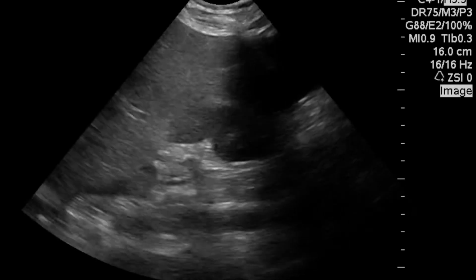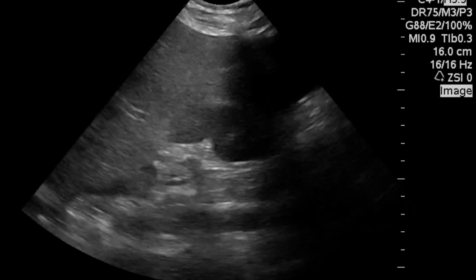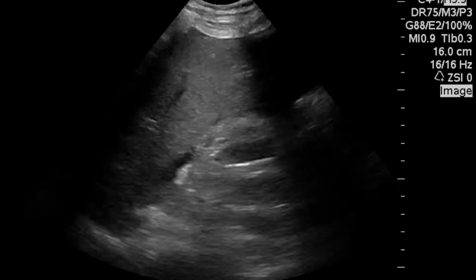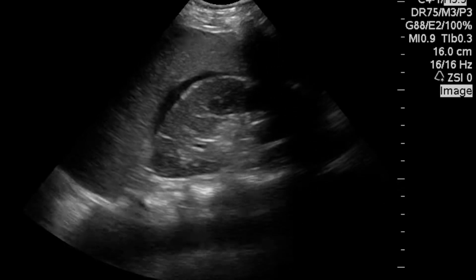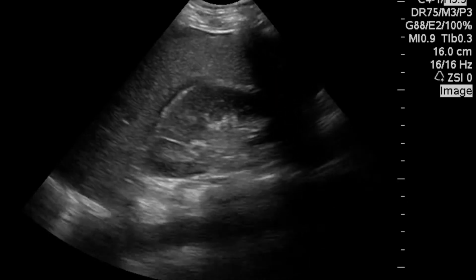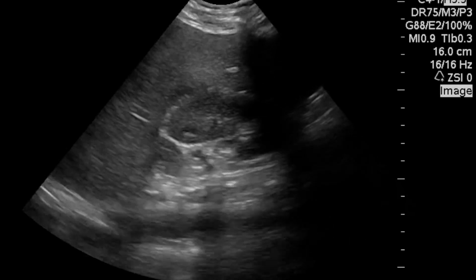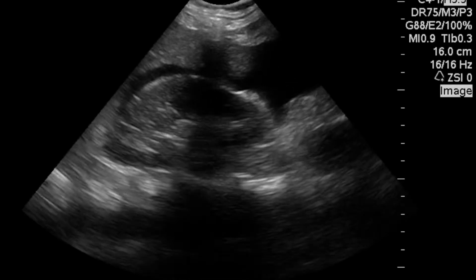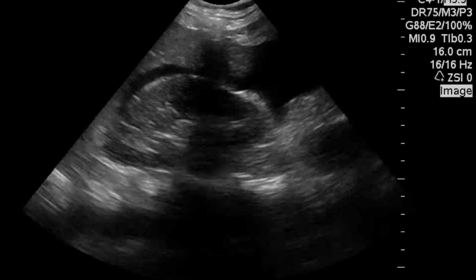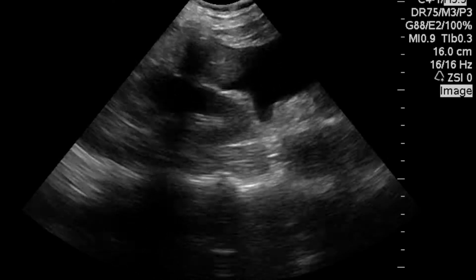So here we have a trauma patient with a frankly positive FAST exam. There is an anechoic fluid wedge between the kidney and the liver in Morrison space, and as the image scans more caudad, you'll see a large collection of black fluid in the pericolic gutter. Nothing really subtle about this exam. I do want to take a second to notice here that we didn't scan cephalad enough here to really prove that the spinal stripe did or didn't extend into the thorax. This scan is incomplete, and I'll show you what a positive extension of spinal stripe looks like here in the left upper quadrant in a second.